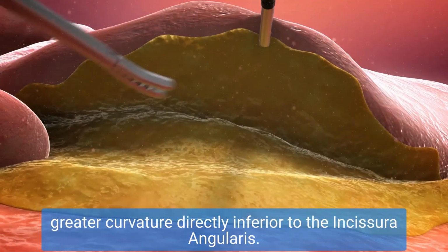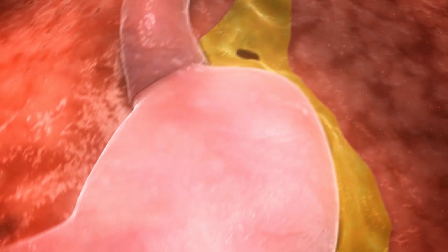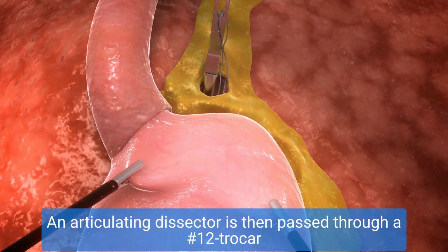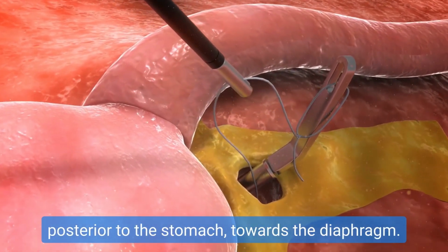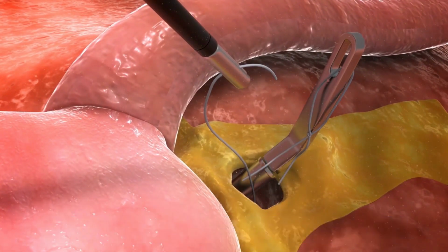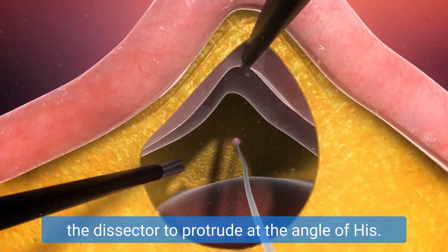a window on the greater curvature directly inferior to the incisura angularis. An articulating dissector is then passed through a number 12 trocar through the window on the greater curvature posterior to the stomach towards the diaphragm. The dissector is passed to the left of the left gastric artery. It is then angled, allowing for the tip of the dissector to protrude at the angle of His.